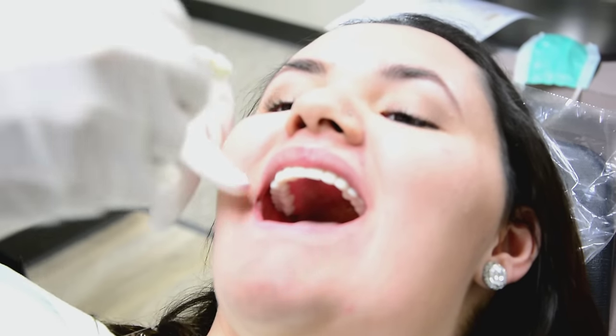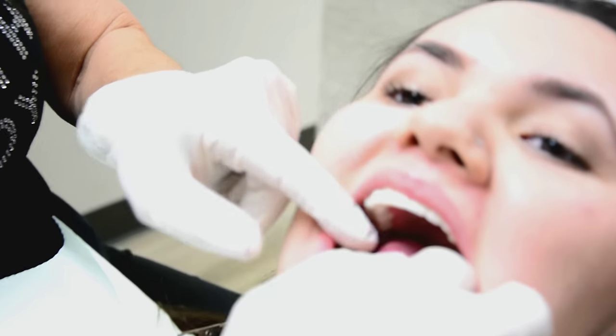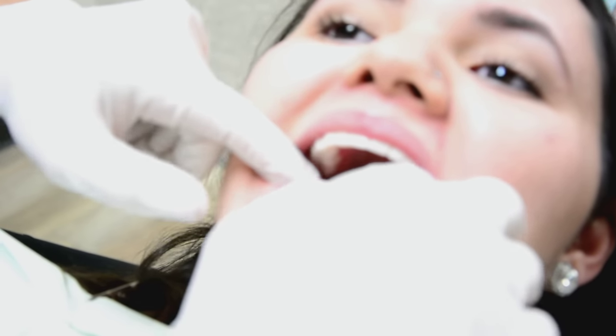On the lower, same thing — you go from one side to the other. We try the right side in first and then the left. Have the patient bite down and take a look. Are you ready? They look beautiful!